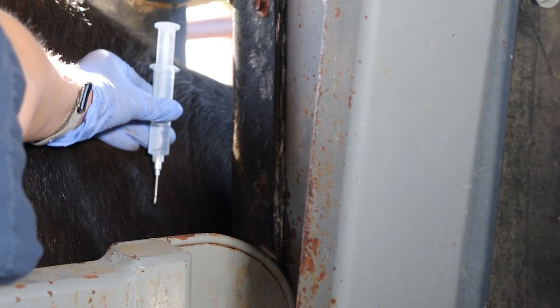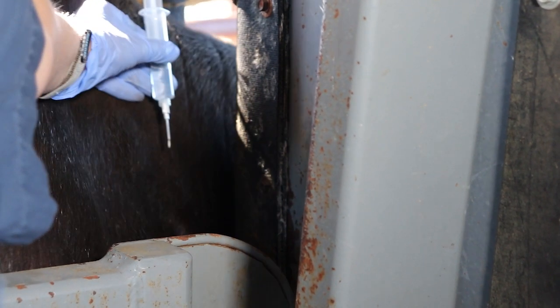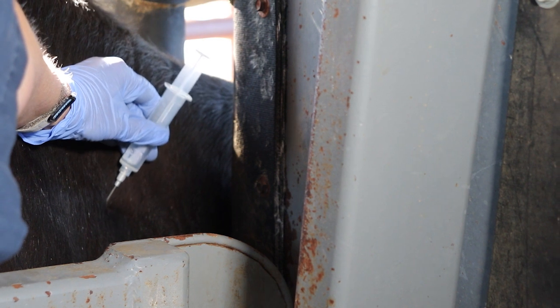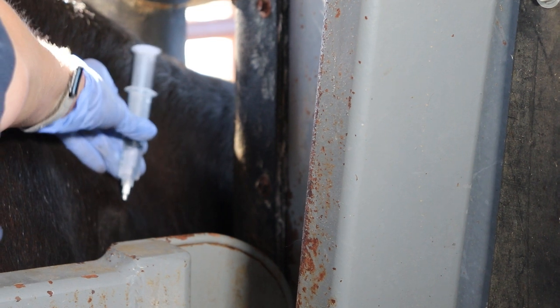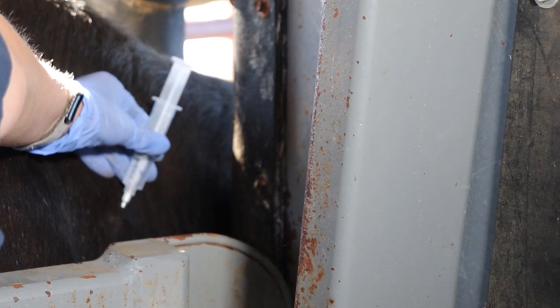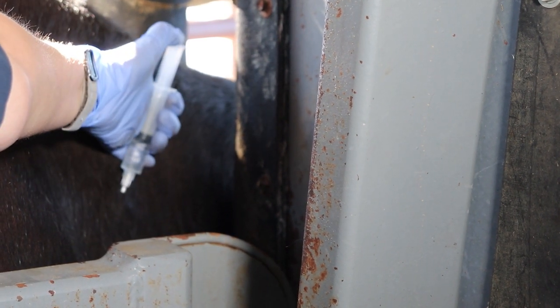Position your hand on the animal so that if it jumps, your hand will move with the animal. This helps avoid injury to you and the animal. Firmly insert the needle at about a 45-degree angle. You will feel a pop through the skin as you get to the correct position. The needle should be freely movable once you have penetrated the skin, and you should be able to lift the skin with the needle.